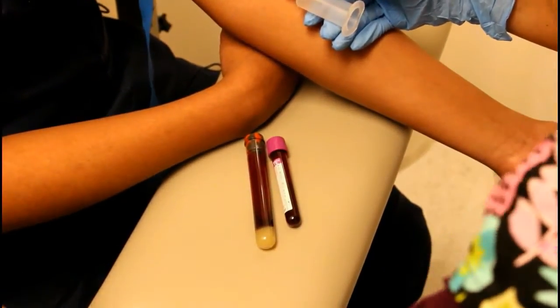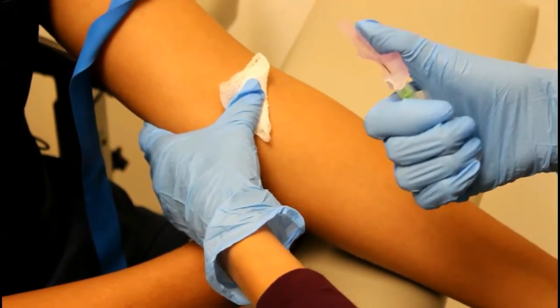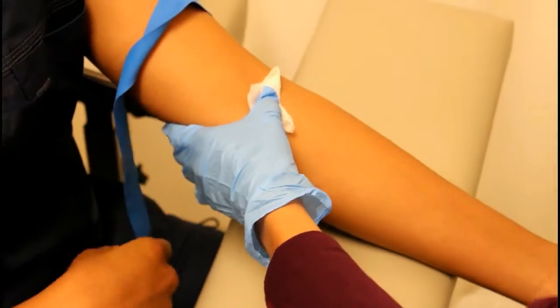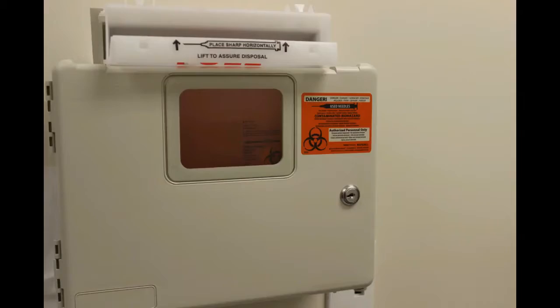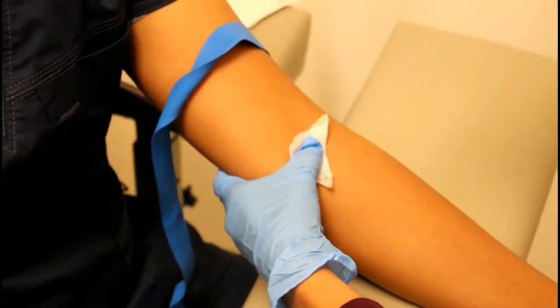Prepare your gauze above the needle but not directly on it. Pull out the needle at the same angle you went in. Place the gauze over the puncture quickly. Clip the safety guard up to cap the needle and discard in the sharps container. Hold pressure on the gauze for about 5 minutes to prevent bruising.